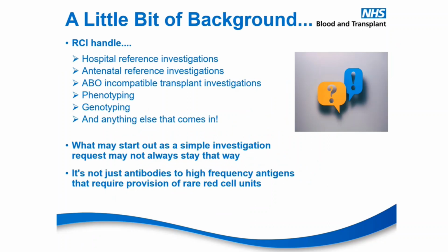So within an RCI lab, we handle hospital reference investigations. We handle quite a lot of antenatal reference investigations. We do ABO incompatible transplant investigations. We do phenotyping and genotyping. And basically anything else that comes in as a reference referral from a hospital transfusion lab. So it's worth knowing that what starts out as what we think is going to be a relatively simple investigation request might not always stay that way, and that it's not just antibodies to high frequency antigens that can require provision of rare red cell units.